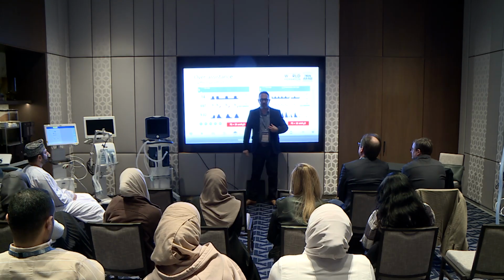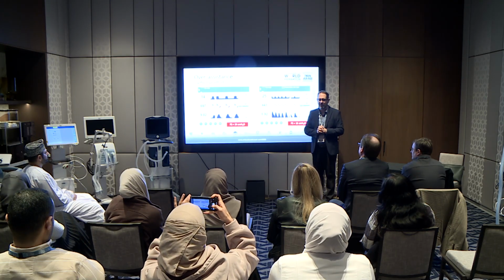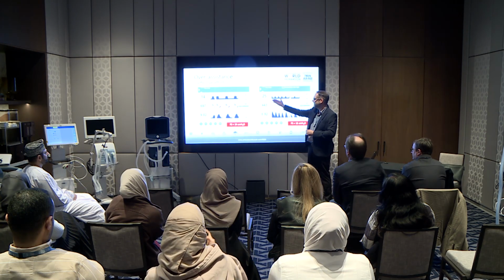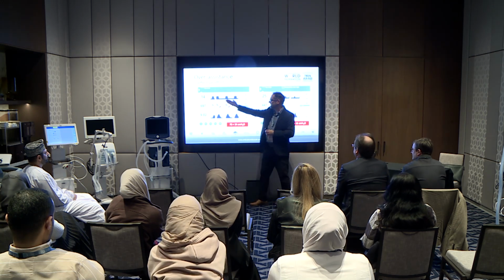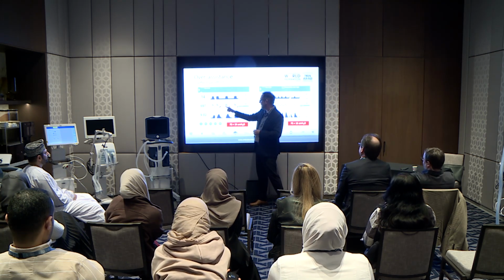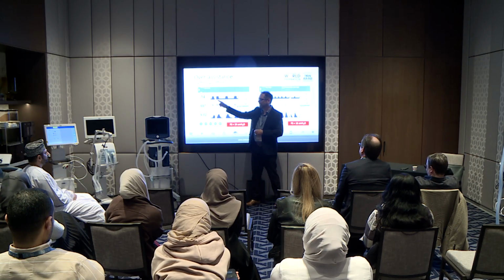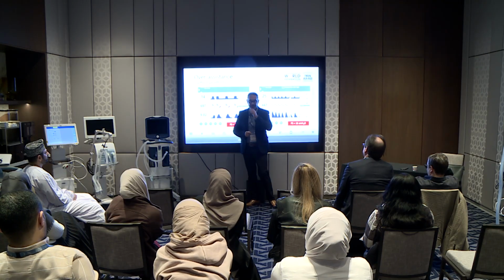But I want to point out, this is about 10 mils per kilo for that patient. And look at the respiratory rate. Guess what the nurses and respiratory therapists have been documenting all day? Respiratory rate of 14. What do you think the real respiratory rate is? Closer to 25. You could guess 28 just by looking, because every breath is followed by a missed breath. So I knew before I fixed this that my respiratory rate was going to go up to close to 28 breaths per minute. I knew that.